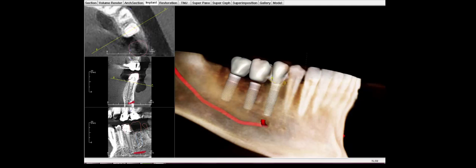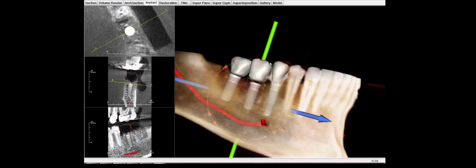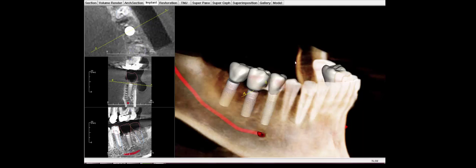When you look at this window over here, you can see the implant fits well within the bone. There's some distance between the nerve. And the bone is pretty wide in this dimension. It's wider than the implant.